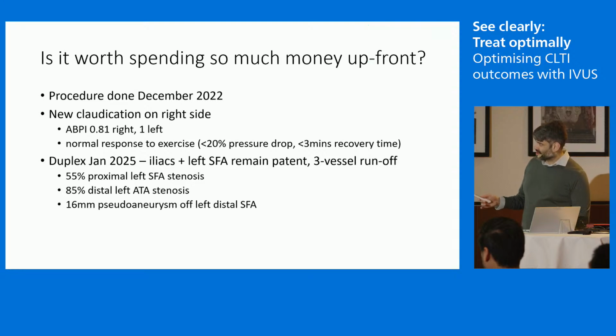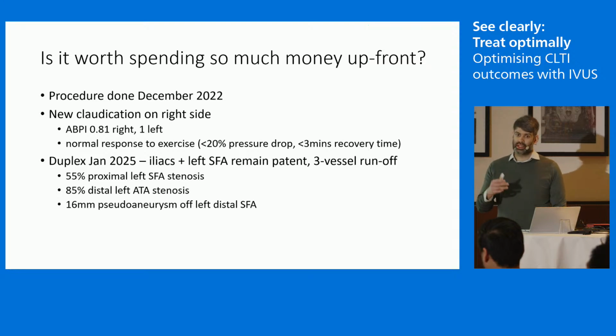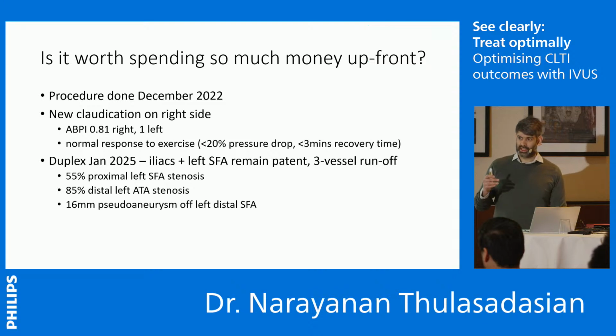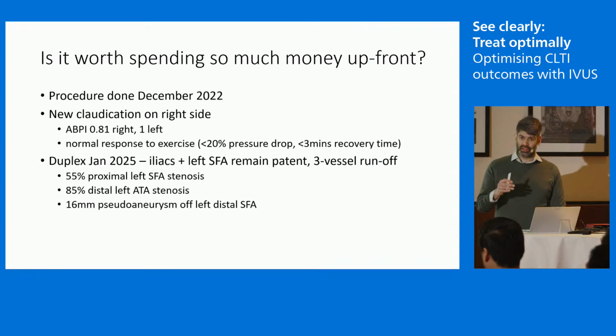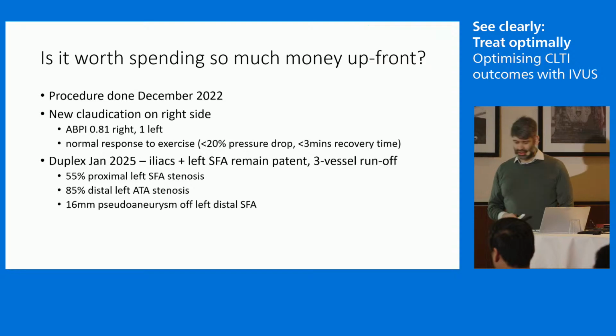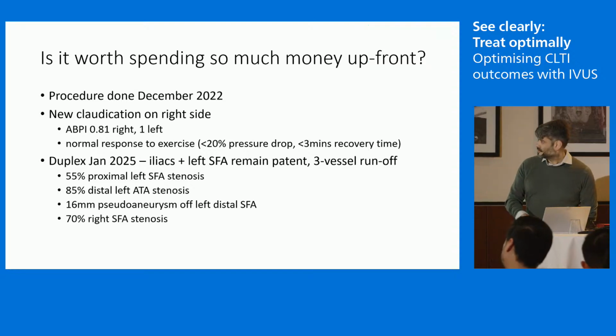And in the end, it feels like his symptoms are more spinal, because that revascularization in very tricky calcified arteries, we threw a lot of money at it at the time, and it stayed open now for 2 years and is still going. So these are the kind of results you can achieve with good choice of vessel prep devices in selected patients. I'm certainly not doing this in every patient, but you're choosing the patients where spending that extra money up front is going to buy you longer term results. And happily he has now quit smoking, which is also good. Cool. That's it from me.